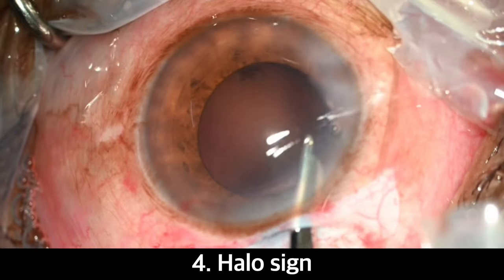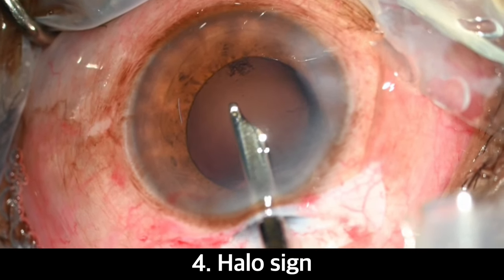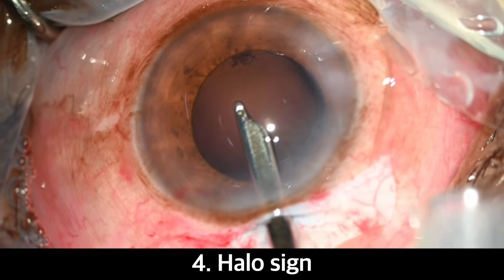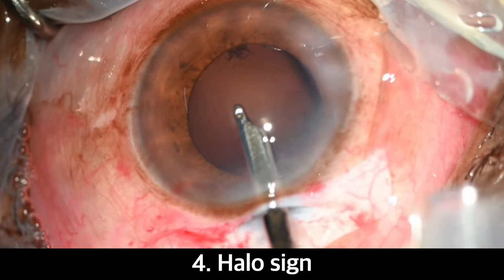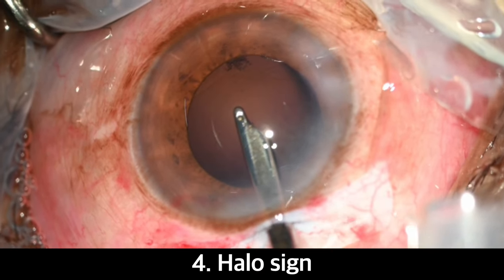Fourth up, we have the halo sign. This one is a bit risky for beginners, but don't worry, we'll guide you through it. It's important to make sure that the posterior capsule is slightly convex, as in bulging up anteriorly. As we gently press at the central convex surface of the posterior capsule with any blunt instrument, it becomes concave and the peripheral area turns convex, revealing the halo sign.